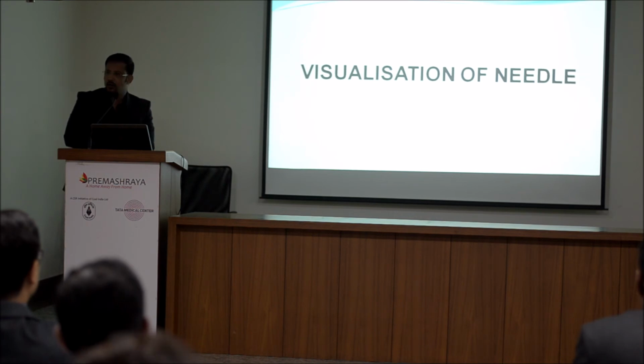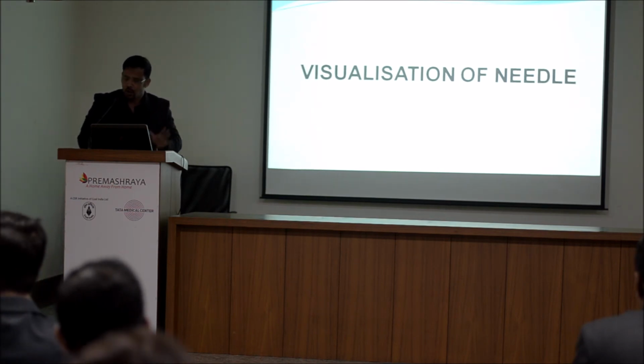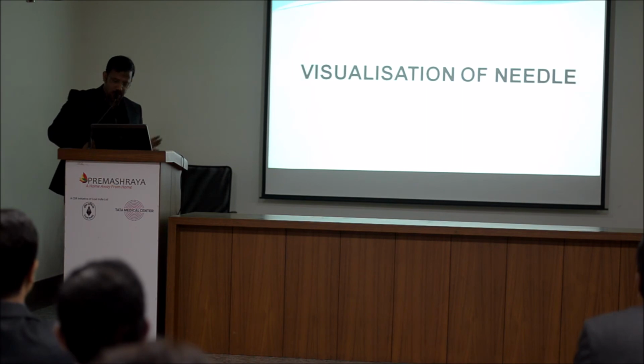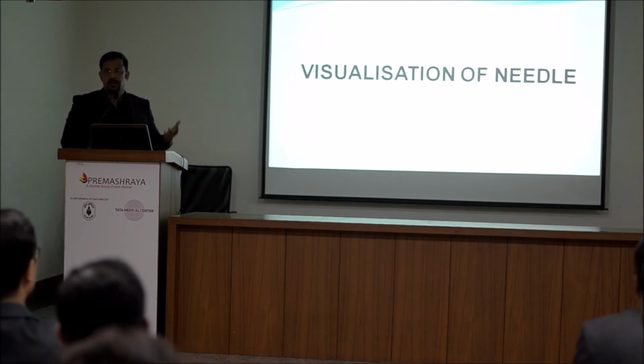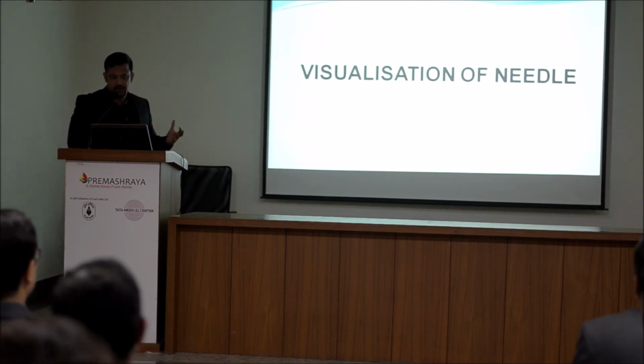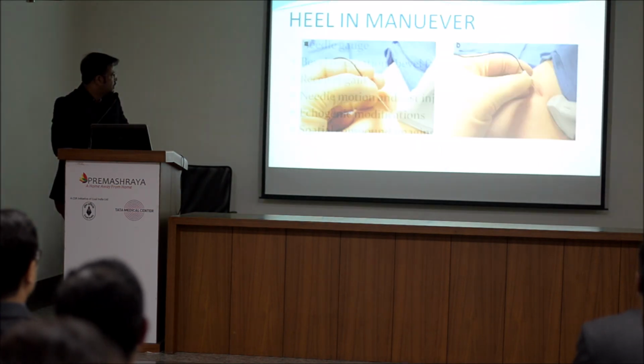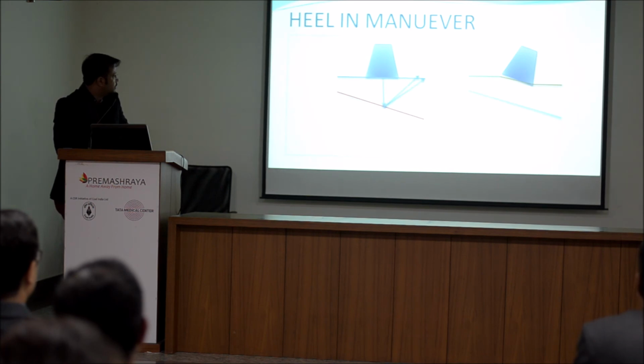Visualization of needle. Time. Am I exceeding the time? Wrap up? Okay, fine. Visualization of needle, I'm not talking about right now, because obviously right now we will be just scanning, seeing. So I think the basic things are enough for you to do the hands-on workshop.